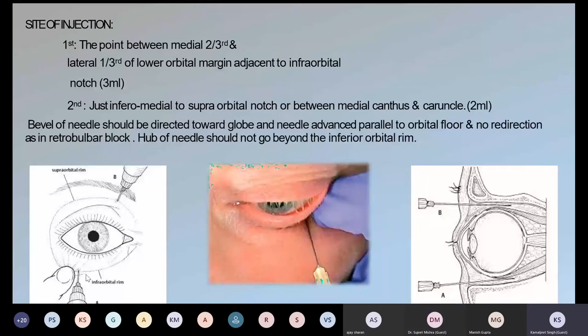Because you have a competition with those who are doing topical anesthesia, many a times as a beginner you would need to do these tricks. These are the tricks sometimes applied with our patients so that they don't get pain. And the hallmark of any surgery is no pain. Analgesia is more important. Patient's anxiety should not be there, otherwise with the pain the patient many a times feels worried and your surgery might go haywire.